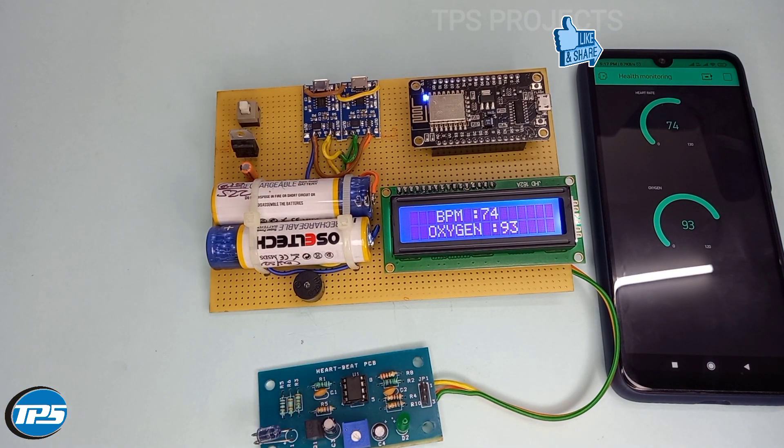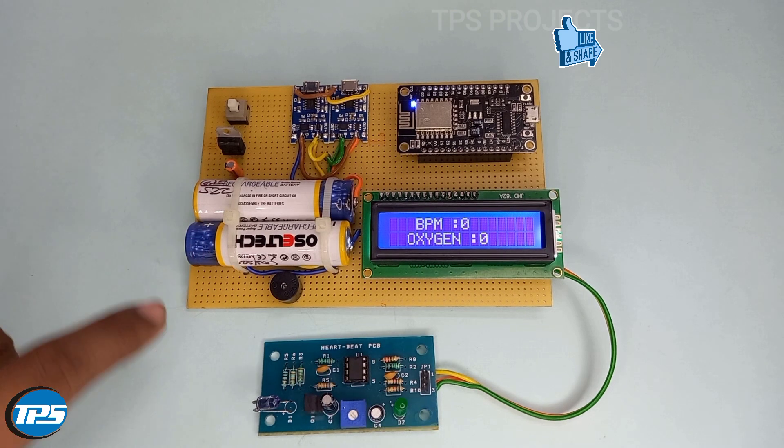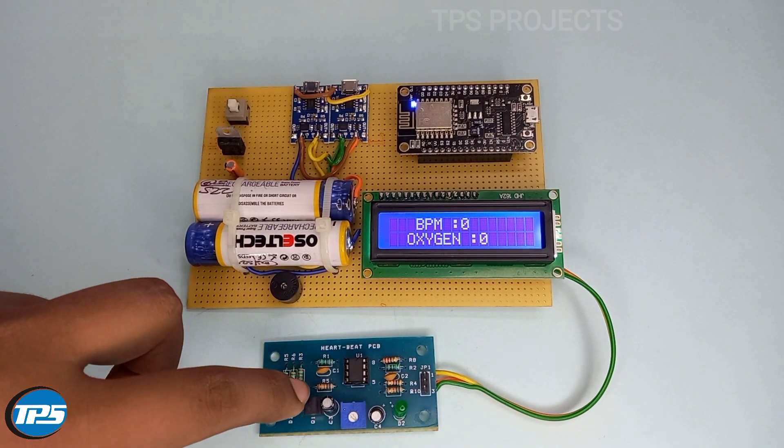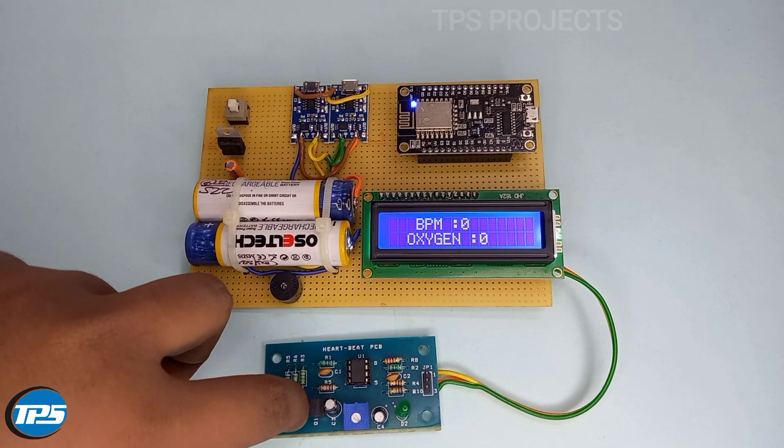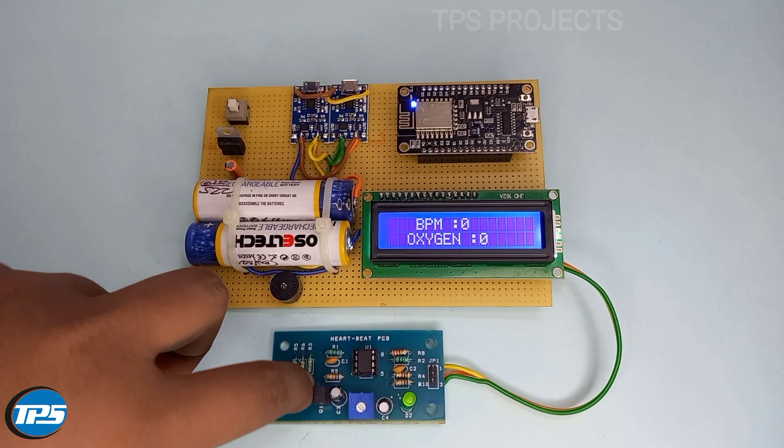Now it is showing again my heartbeat rate and oxygen level. Now I am taking a reading. Before 30 seconds it shows a low heartbeat, so it sends an alert message to the system.